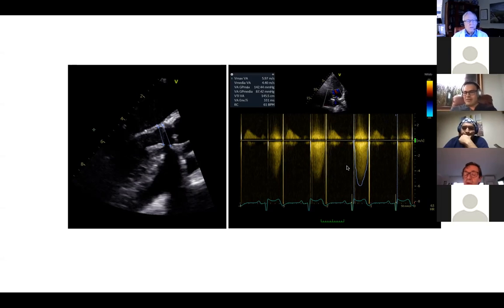This is a case we haven't solved yet, but with the return of Juan, we have some ideas, but I'm happy to hear the opinion of the experts. So I finish my part, and I give the word to Juan to continue the presentation. Well, in the last case, in summary, is a 33-year-old lady. She has a normal aortic root. The annulus is around 17, but the LVOT is 12.